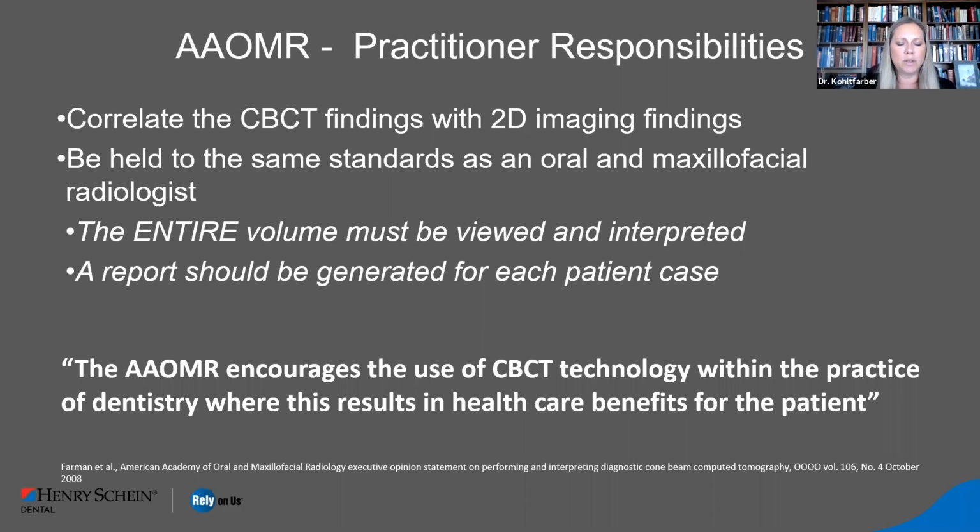What are our responsibilities as far as viewing the volume? Well, the entire volume must be viewed and interpreted. And then it says a report should be generated for each patient case. So this is letting us know that we need to evaluate the entire scan.